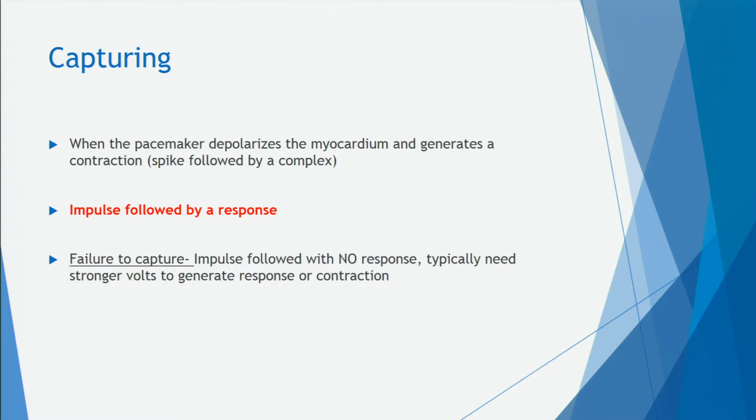So when you get ready to connect your patient to the, I'm just going to talk through the crash cart because it's the same concept no matter what you get ready to do. Okay, so right now this is a patient that's in sinus Brady. Their heart rate's in the 40s. Can everybody see okay? I can come around this way.